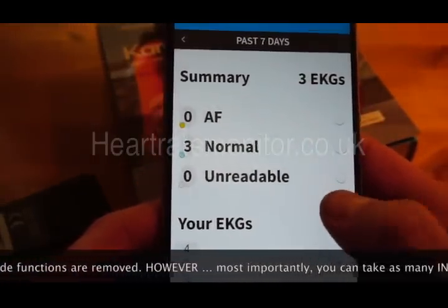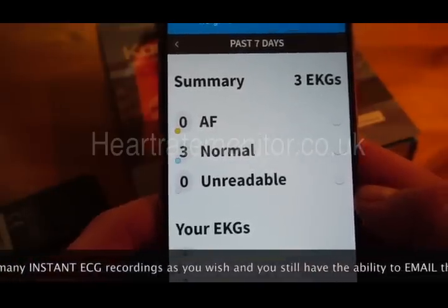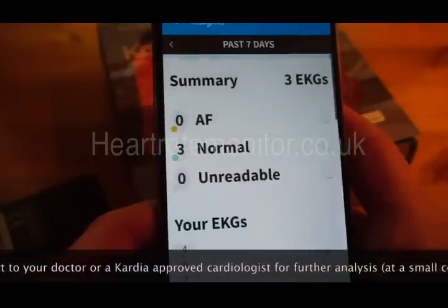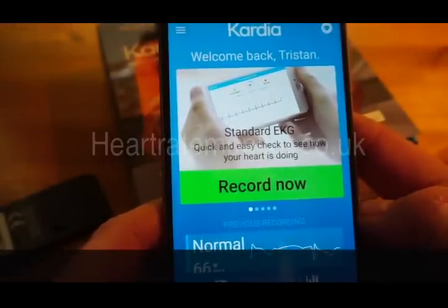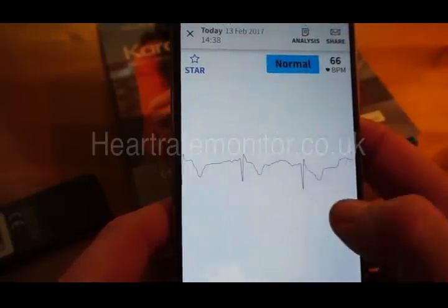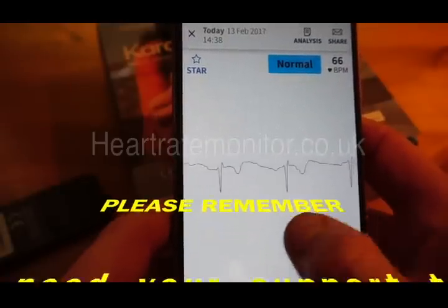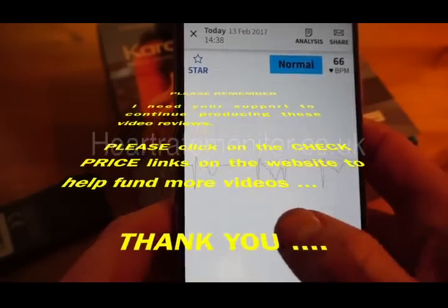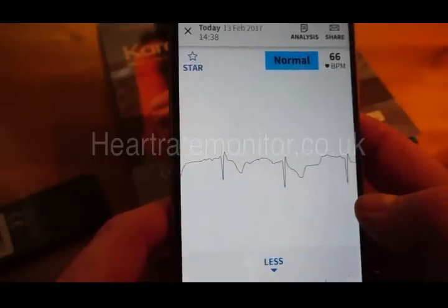The insights section gives you a review of the readings you've taken. Currently none are showing any AF or atrial fibrillation, so all readings are normal and no concerns there. I'm not medically qualified and can't pass a medical judgment on it; however, the important thing is that the people at NICE in the UK, who authorize any medical devices or medications, have approved this device. On my website I've put a link to more information about that.